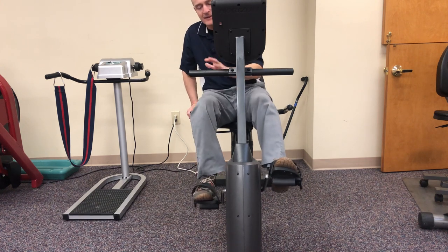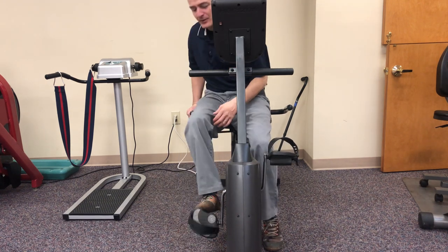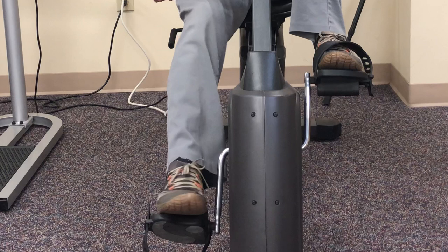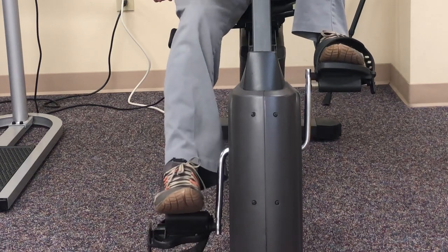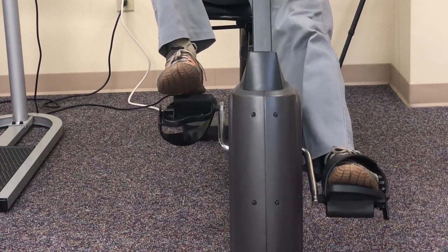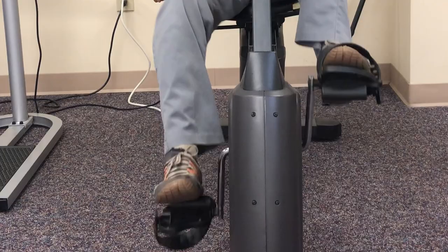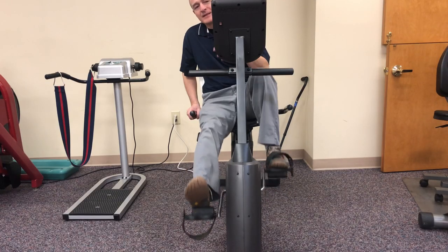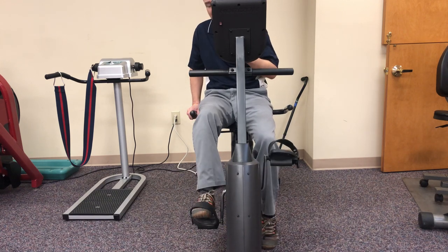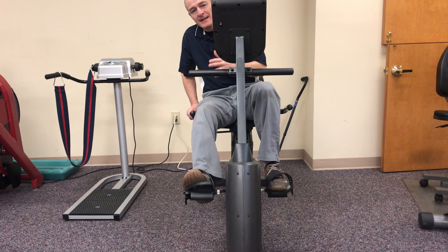If you're absolutely stuck and don't have the range of motion to make that turn over the top, a little hack is to flip the pedal over and put your foot on top with no strap. Now you're moving the pedal closer to the heel, so in a sense the surgical leg becomes shorter and the non-surgical leg is longer. As you come over the top it requires less knee flexion, and it's usually a little bit easier to make those first couple revolutions. You're building confidence, getting comfortable, and your brain and body understand the motion. Then flip the pedal back, get the ball of your foot on it, and pedal in a more normal fashion.